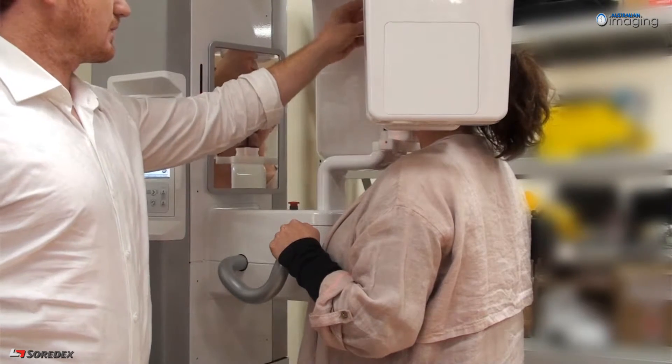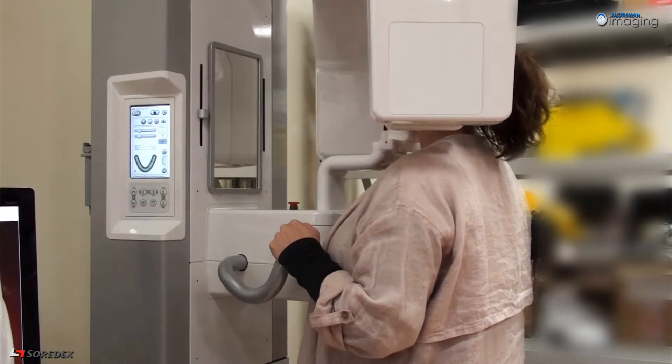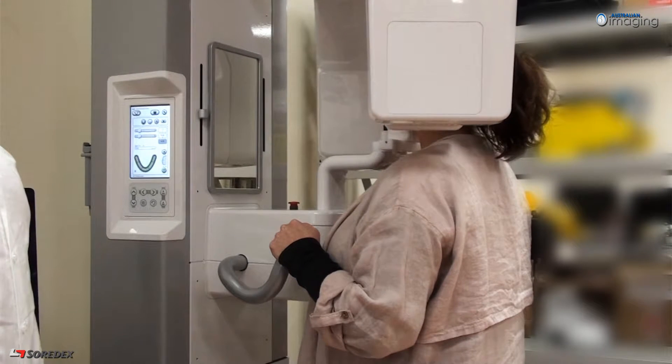Bring the headrest into position and close the temple supports. Once you are happy with your patient position, press the return button, leaving the settings on automatic exposure. The unit is now ready to take the image.